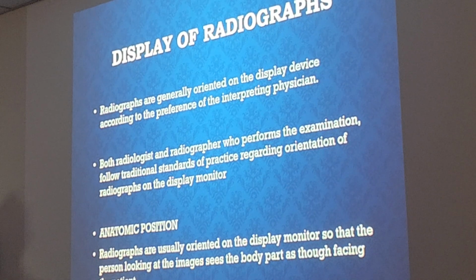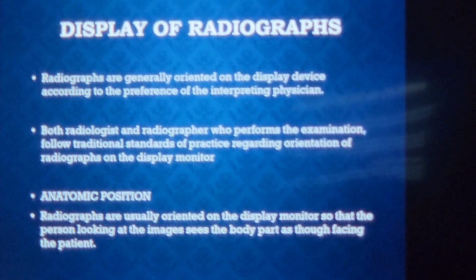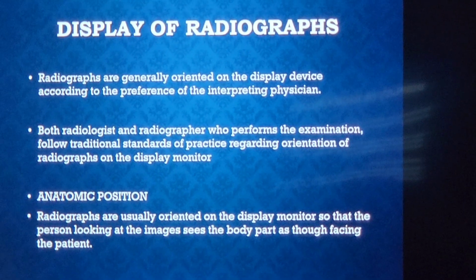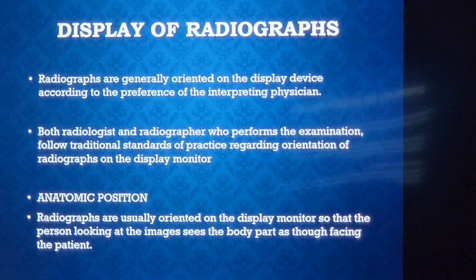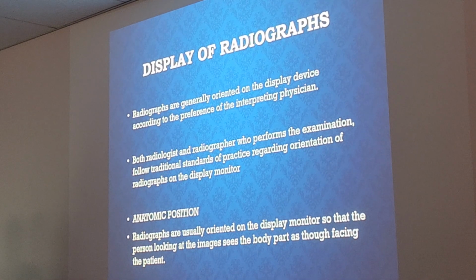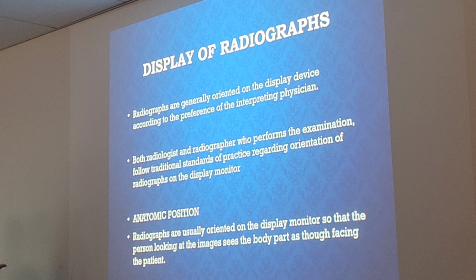But at MD Anderson, some of the radiologists prefer all of their lateral extremities facing west. That's just their preference. So it's not like if you see something done one way at Harris Health, it's going to be the same thing at all hospitals. It truly depends on the radiologist. Is that post-processing or is that in the positioning? Post-processing. Okay. So you would do the positioning as regular, but you would just flip it. Okay.